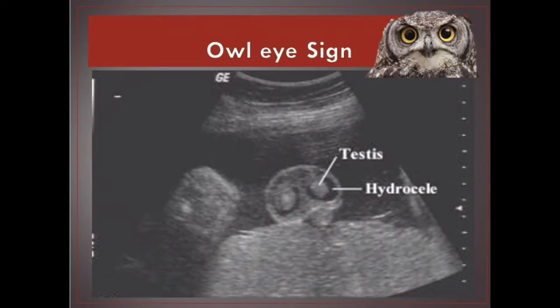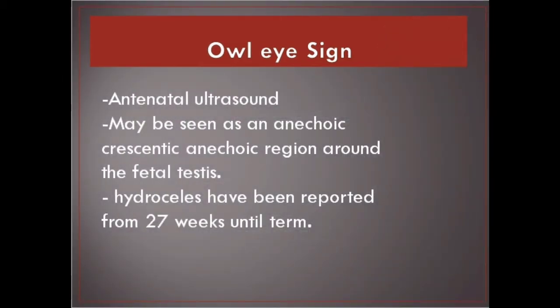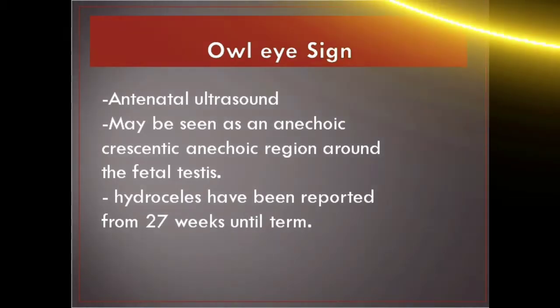Owl eye sign. On antenatal ultrasound, this may be seen as an anechoic region around the fetal testis. Hydroceles have been reported from 27 weeks until term.